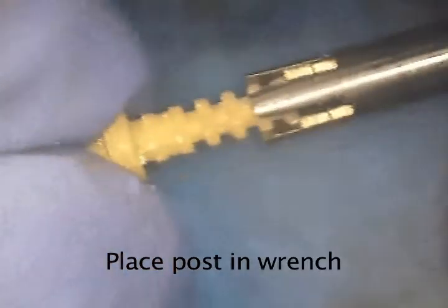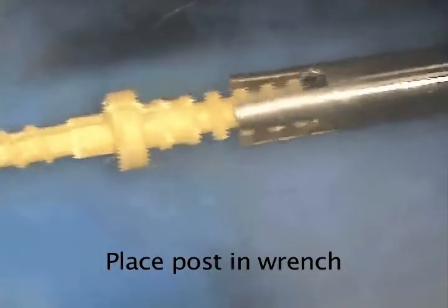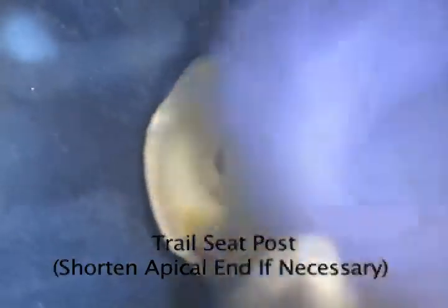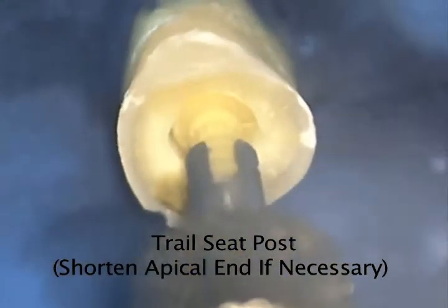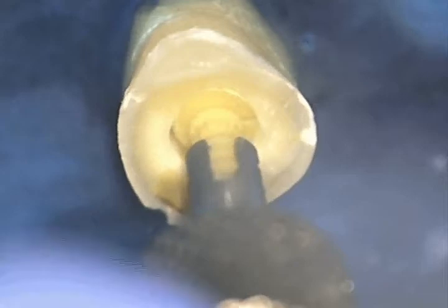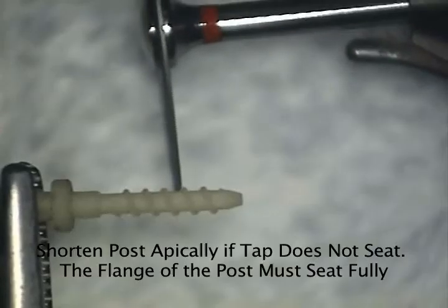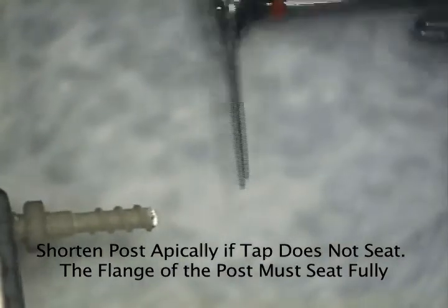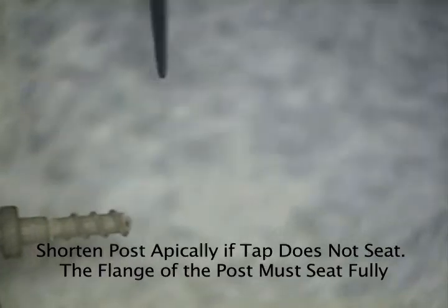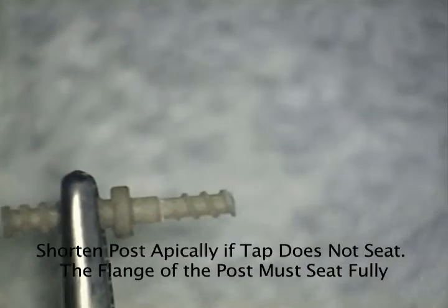The number two FlexiFlange fiber post is now placed into the wrench and trial-seated into the root without cement. Once you see that the flange does not fully seat into the countersink preparation — that is, flush with the coronal dentin — the post must be removed and the apical end of the post must be cut until the flange seats completely within the countersink preparation. Once the flange seats completely, the post is removed from the root.